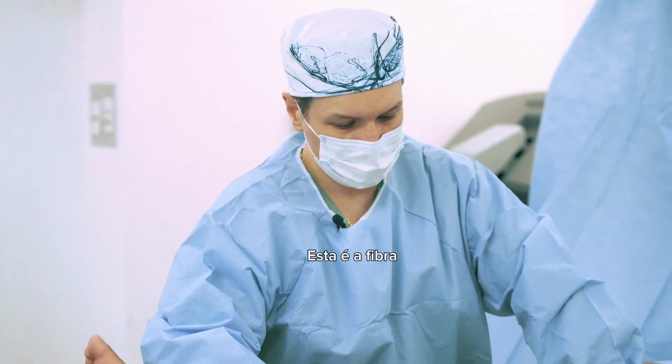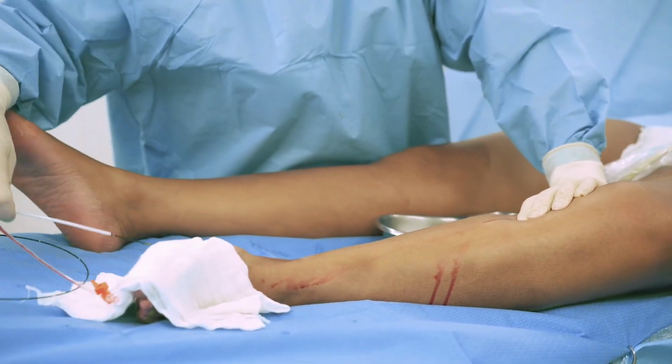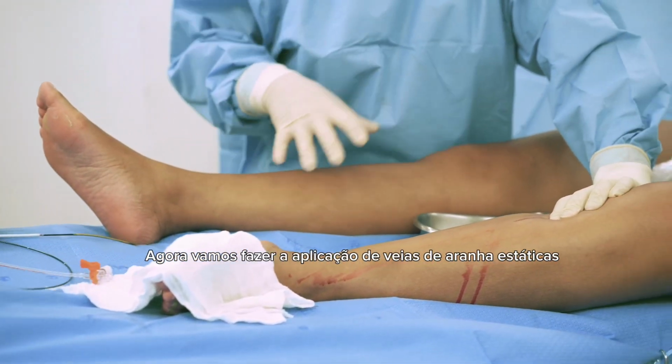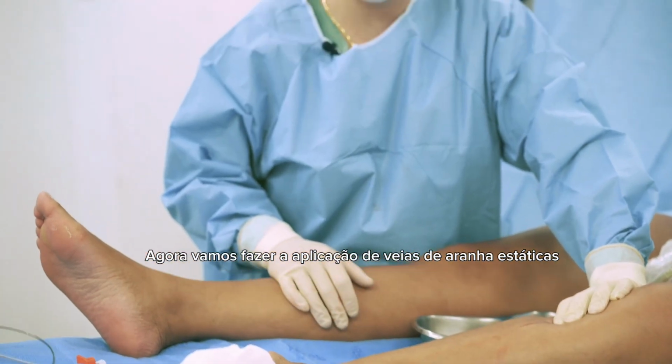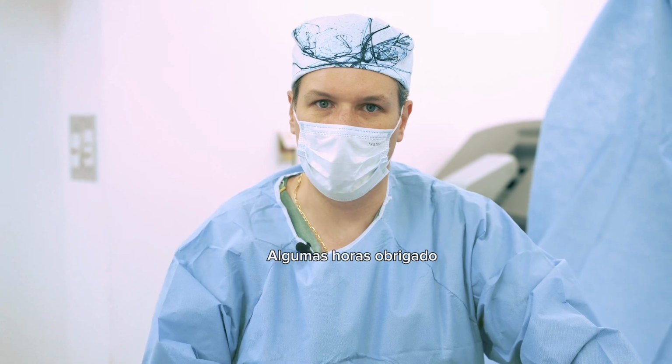This is the fiber away from the sheath. We just finished the procedure. Now we're going to do the aesthetic spider veins application, and the patient is going to be ready to go home after a couple of hours.